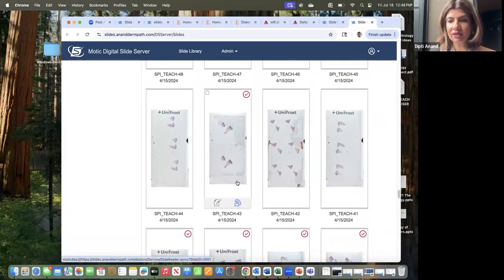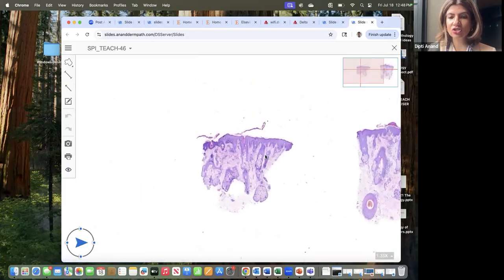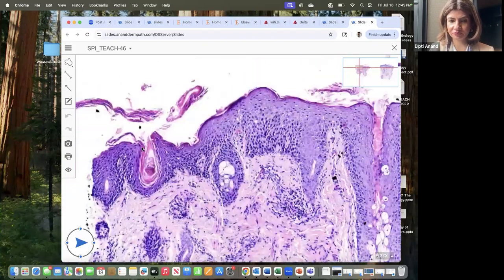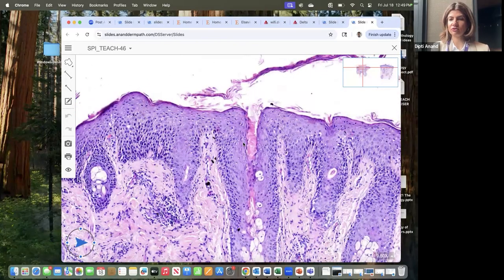Okay, the next one is seborrheic dermatitis. So seborrheic dermatitis, you're largely going to recognize it. It's not a really important board question. It is a psoriasiform pattern on the seborrheic areas of the body, which are recognized by prominent sebaceous glands and numerous vellus hair follicles. So you know you're biopsying somewhere from the face or the head and neck area. And you see psoriasiform hyperplasia with the lipping of the follicular ostium, the parafollicular parakeratosis.